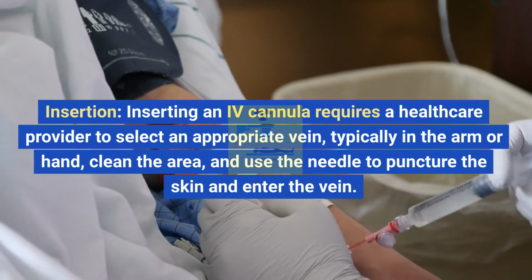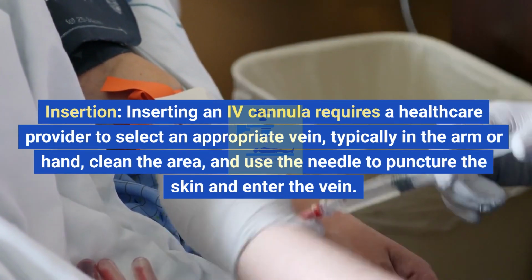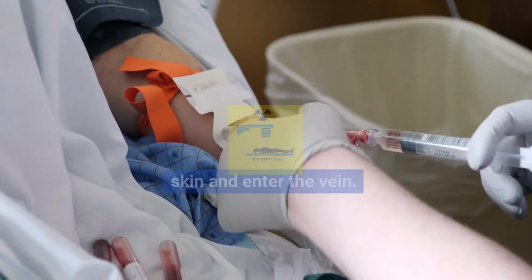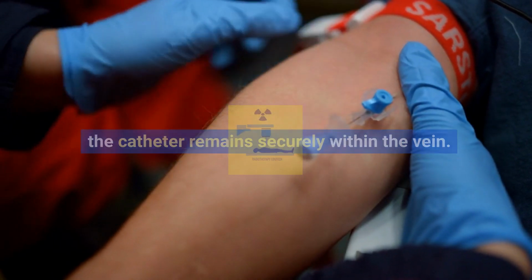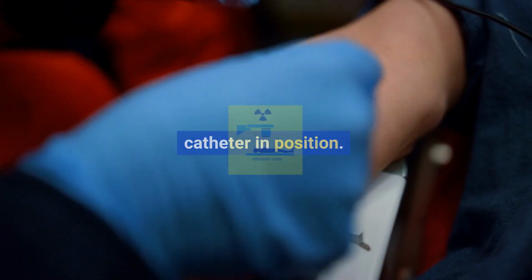Insertion: inserting an IV cannula requires a healthcare provider to select an appropriate vein, typically in the arm or hand, clean the area, and use the needle to puncture the skin and enter the vein. Once the catheter is in place, the needle is withdrawn, and the catheter remains securely within the vein. The wings on the hub are then taped down to hold the catheter in position.